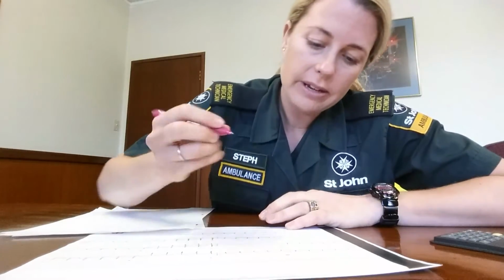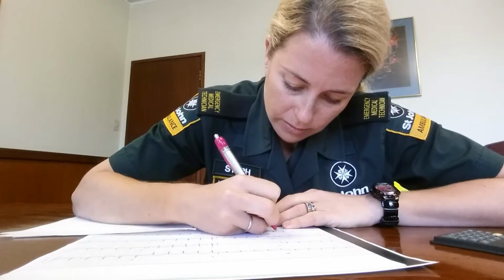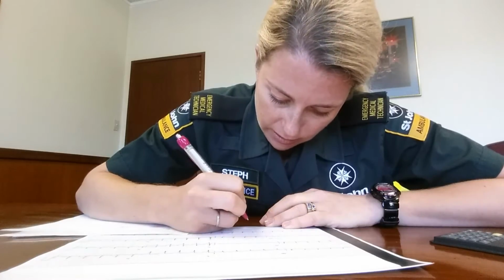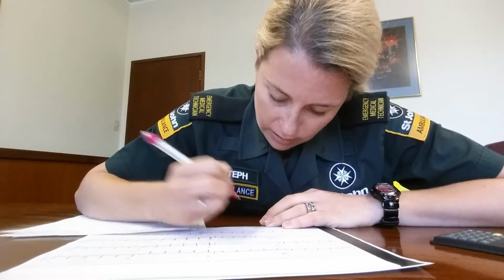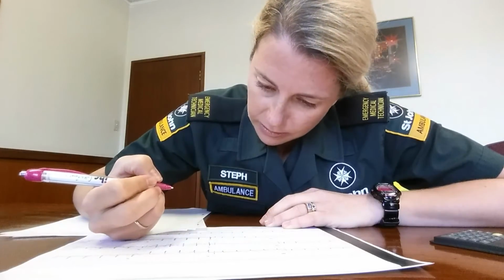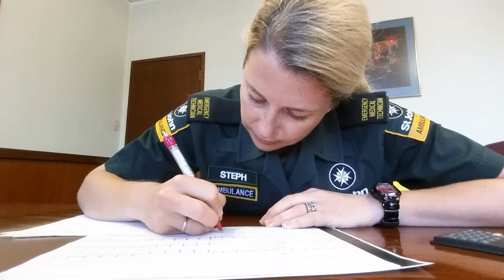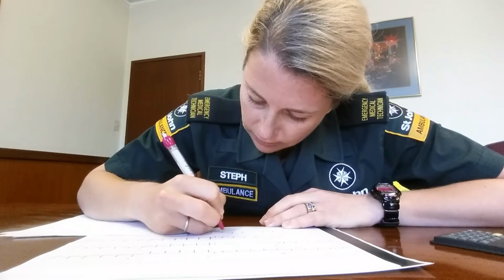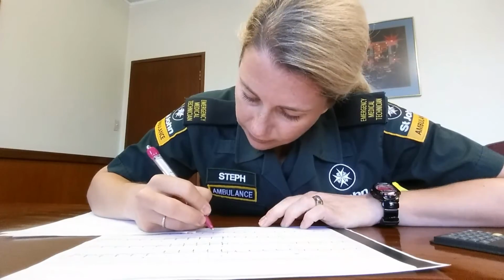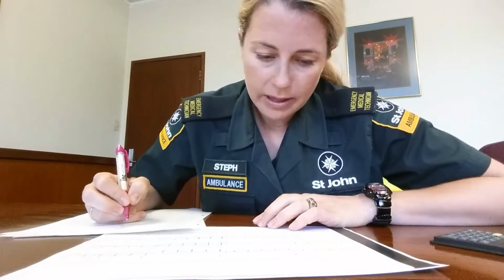And then we're looking for our PR interval, which should be between 0.12 seconds and 0.20 seconds. And regular, which they are, constant at about 0.20 seconds, so they are not prolonged with no heart block. Yeah, they're sort of right on. Okay, so no heart block there.